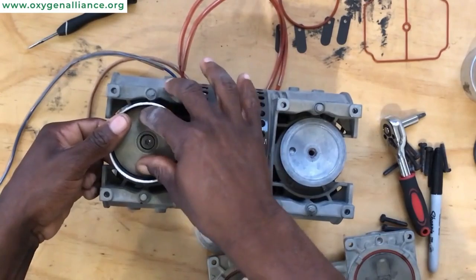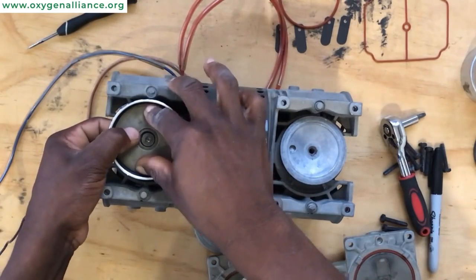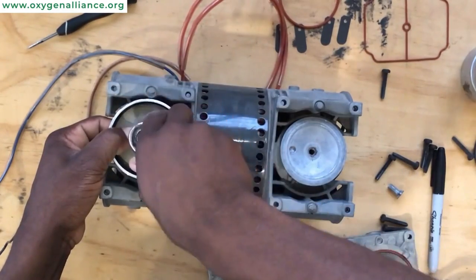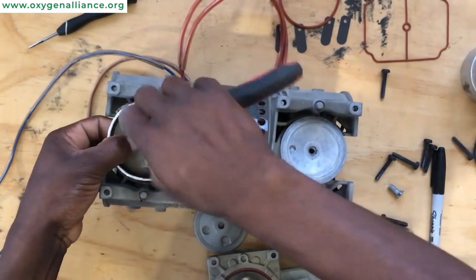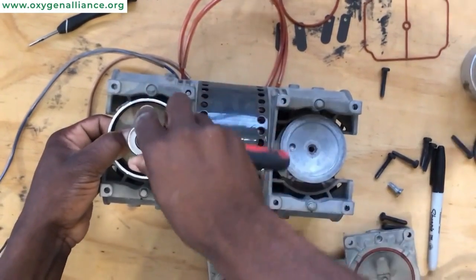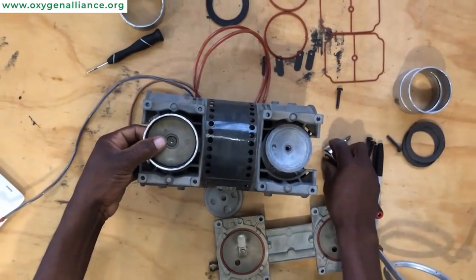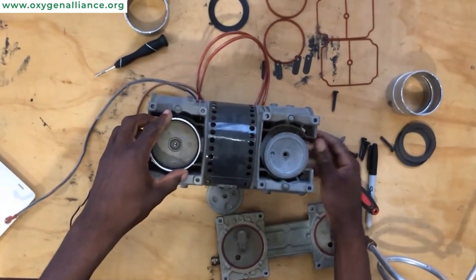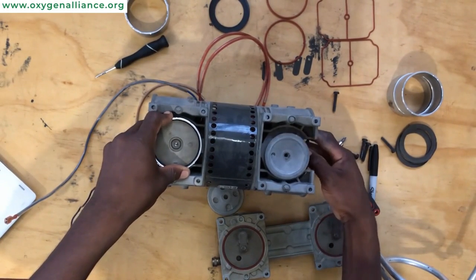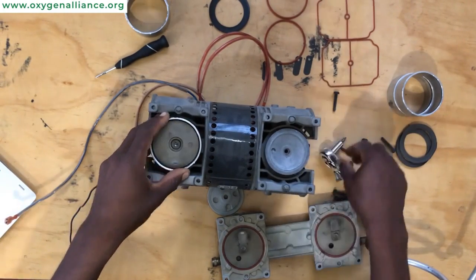When replacing the screw, don't tighten it the first time because you need to check and make sure that the cup retainer is rotating and locked into place. Once you feel it's nicely locked into place, you can tighten it up so that it doesn't get loose when the compressor is running. Once placed, you can try and rotate it a bit just to see if the piston cup is nicely aligned inside the cylinder sleeve.